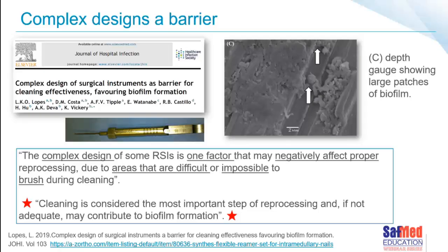Here's another paper that talks about complex designs. It says, complex designs of surgical instruments as a barrier for cleaning effectiveness, favoring biofilm formation. The authors go on to state that a complex design of some reusable surgical instruments is one factor that may negatively affect proper cleaning due to the areas that are difficult or in some cases impossible to brush during cleaning.